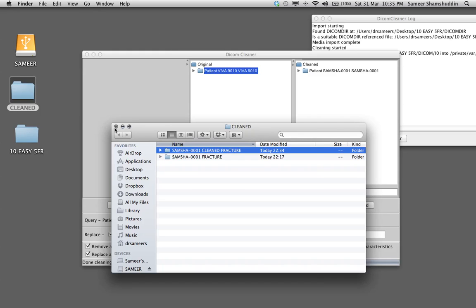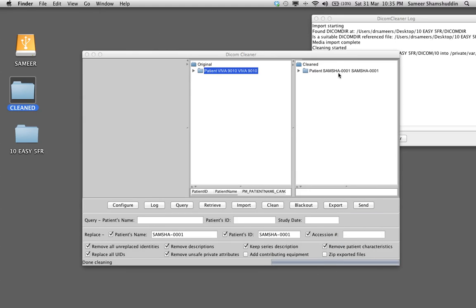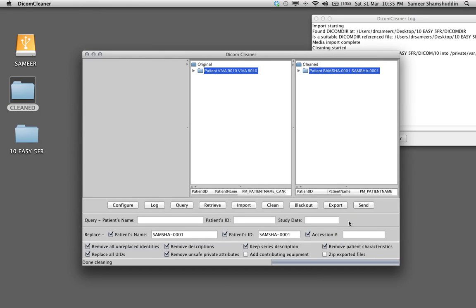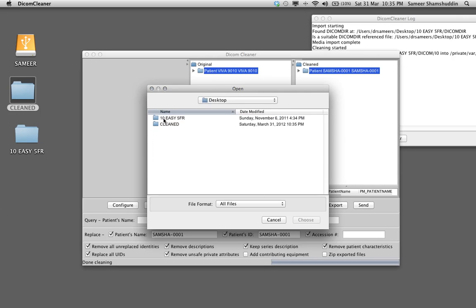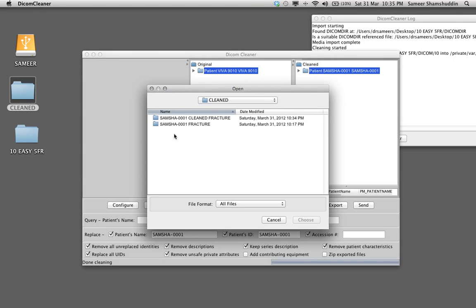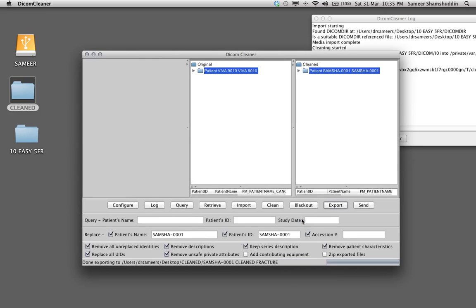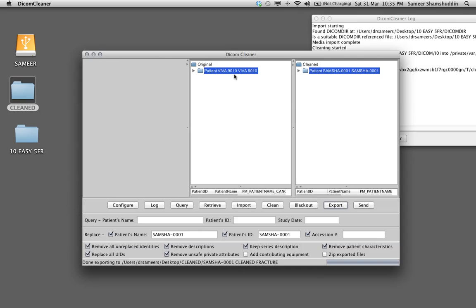Close this one. Select the case, click export and then just select that folder. So under desktop, cleaned, cleaned fracture, say choose. You can see that you get a message saying done exporting to with the file path so that we have completely anonymized this case into a new case.